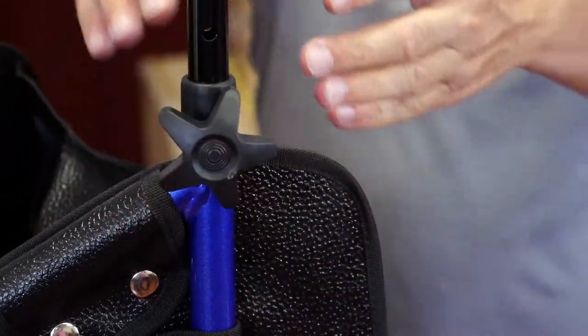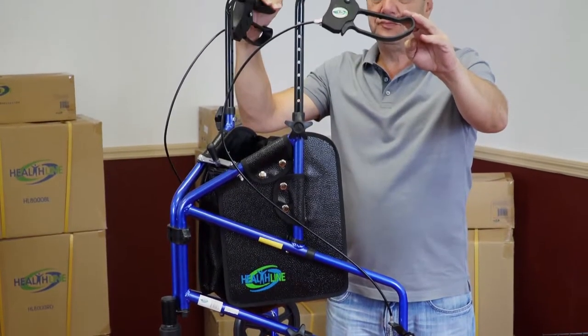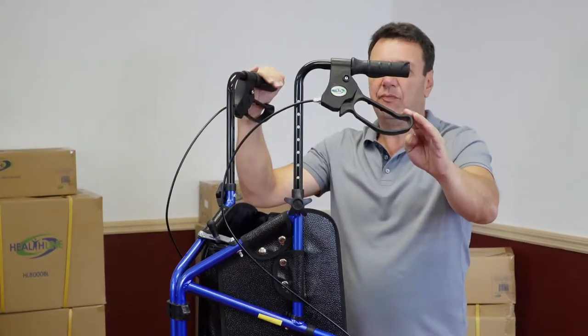Repeat the wheel and handlebar assembly procedure for the other side of the Rollator. When you are done, push the handbrake all the way down to lock the wheels. This will prevent the Rollator from sliding around and getting away.